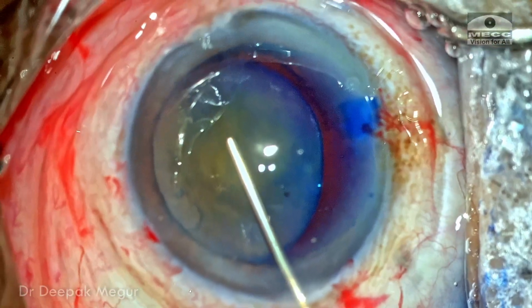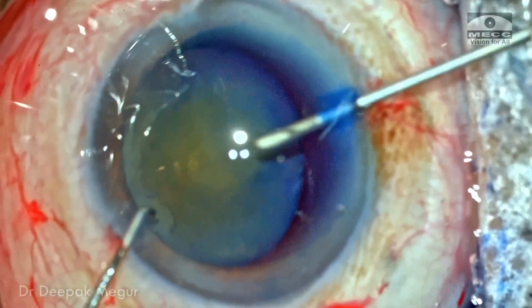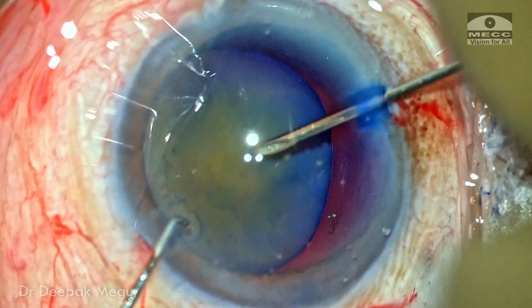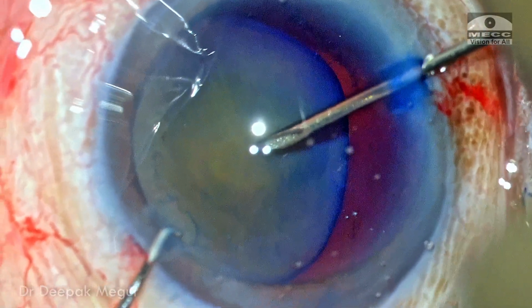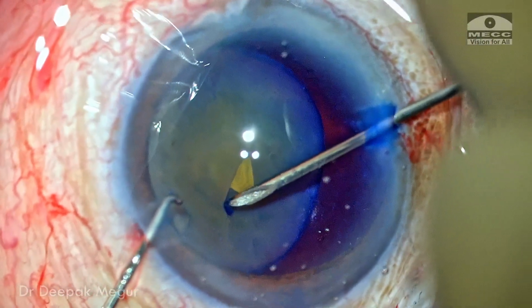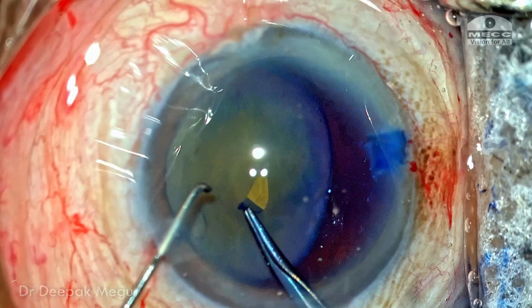Now typically I puncture the capsule with the forceps itself, but this being a weak bag, I consciously decided to use a 26-gauge needle just to puncture the capsule and raise a flap. And the moment I touch the capsule, this is the time when I really come to know the strength of the capsule and the zonules. As I'm puncturing, I notice that the bag is wobbly. Nevertheless, the anterior capsule is punctured and the flap is raised. The rhexis portion I'm going to show in slow motion, as there are many things to observe.